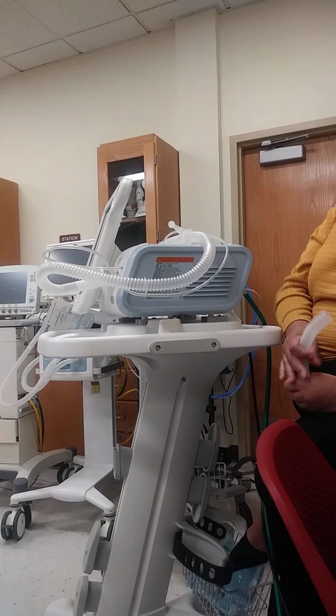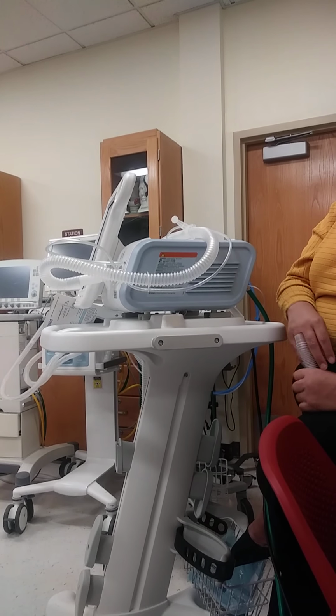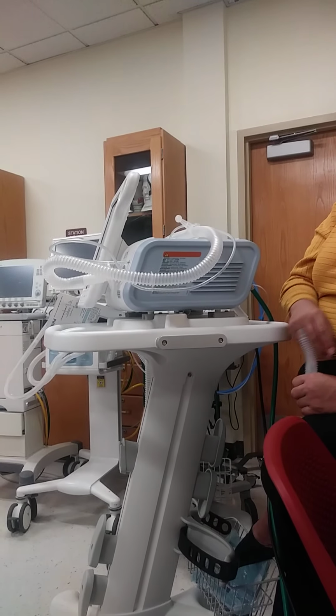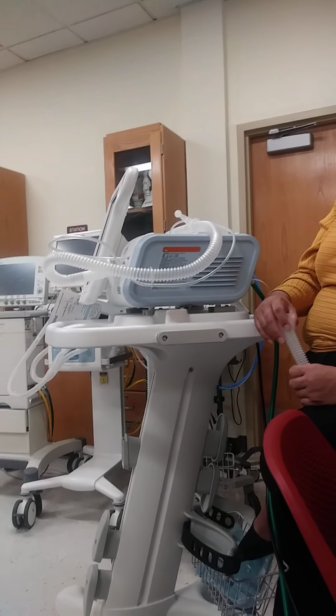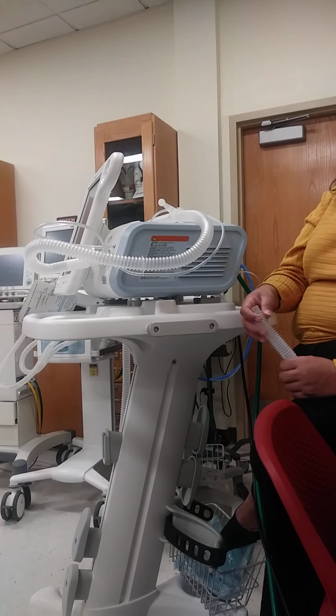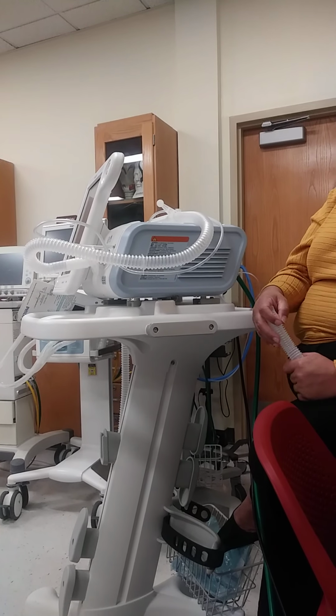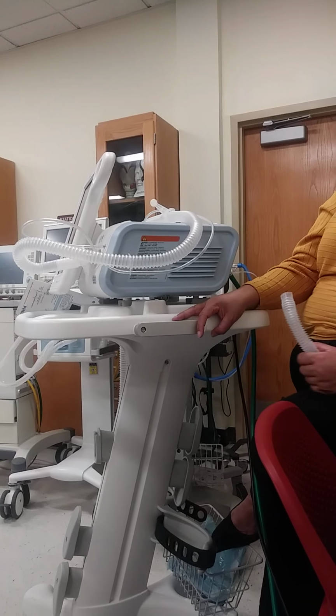Good question. What would be a hazard for that? Them choking, aspiration. A hazard is that I can cause aspiration. This is a pressure that I'm delivering, so I can cause a pneumothorax. You guys know what a pneumothorax is?